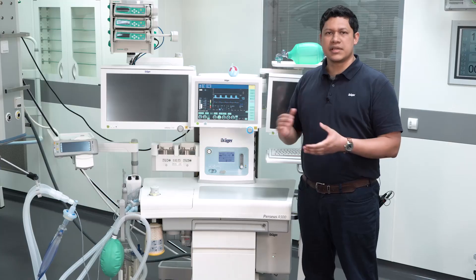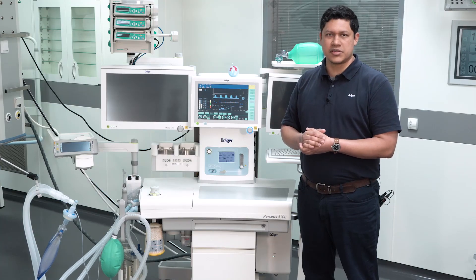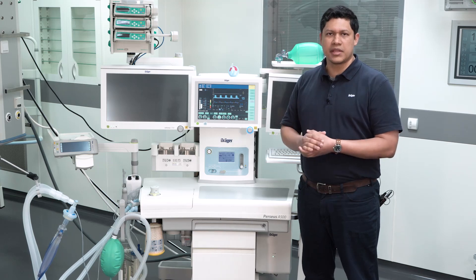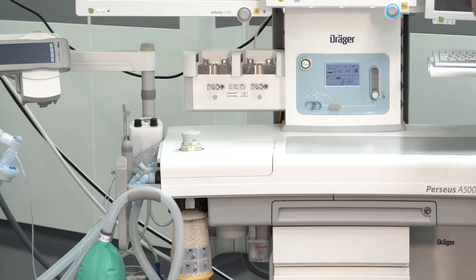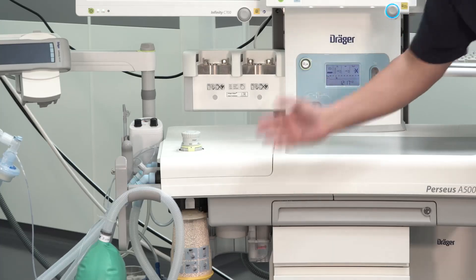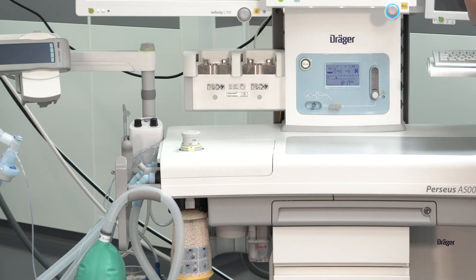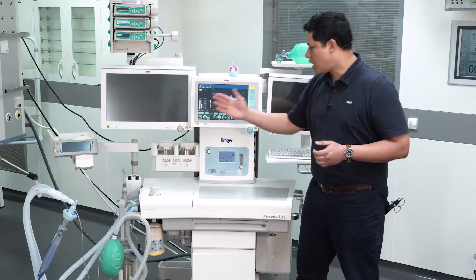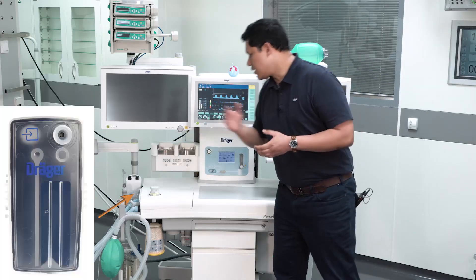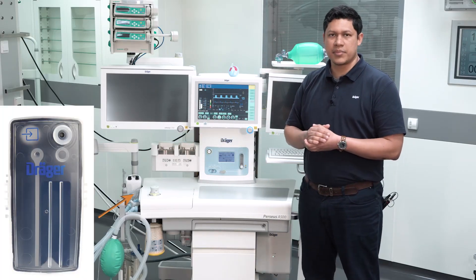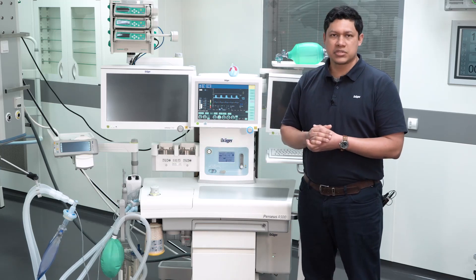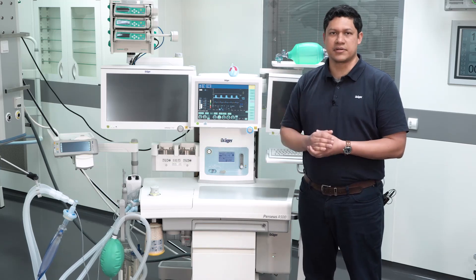When using the anesthesia device for long-term ventilation, you have to regularly check all the accessories on it. You will have to visually inspect the condition of the soda lime and also the inspiratory level of CO2. You have to check the gas measurement water trap, the breathing hose system, and the patient filter.